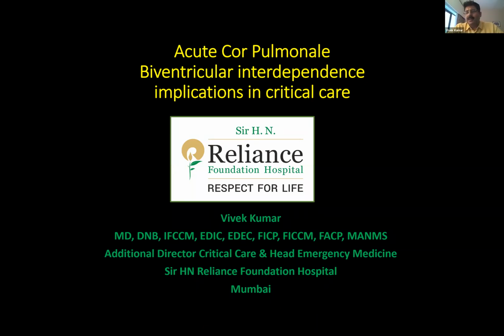Thank you, everyone. Thank you, Akhilesh. Thank you, Gunadhar. There was a time we worked together, and I think most of the loops are from those times. So good evening, everybody. My talk here is basically aimed to improve your understanding of hemodynamics at the bedside by improving your understanding of the physiology of what is going on. And the tool you will be using to understand the physiology and improve your clinical work will be echocardiography.